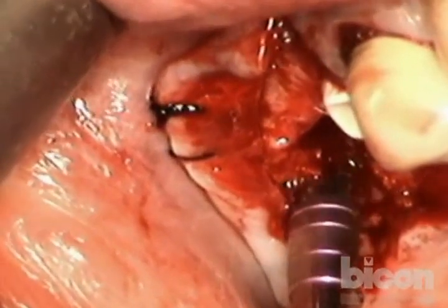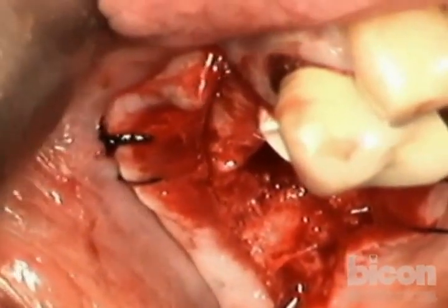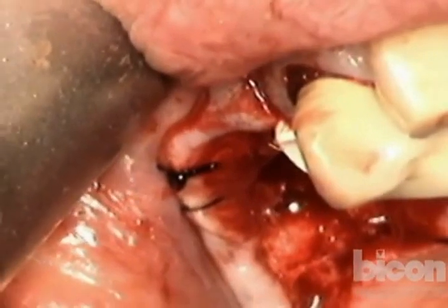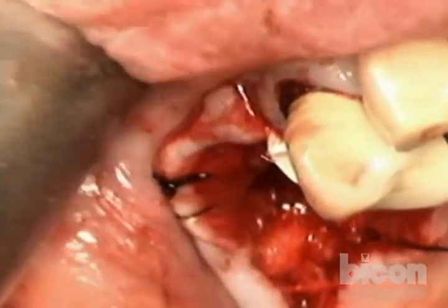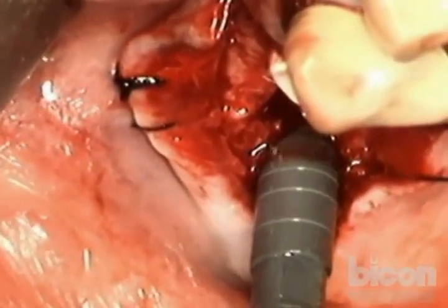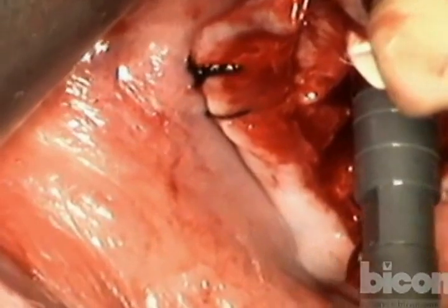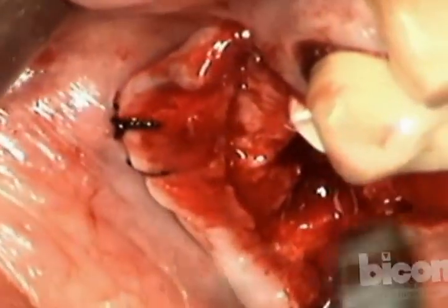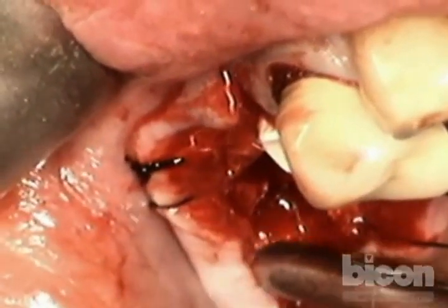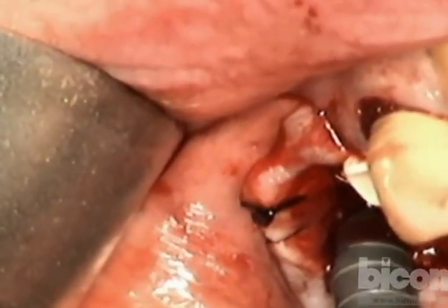Try not to shake like that, if you can help it. Yeah, good job. And what I will do now is use a site expander in the posterior one to see where I am. And I will combine that with the hand reamer. And I'm using the expander in a circular fashion. Okay, hold that. This is basically just a blunt instrument, and you can use it by tapping it in as well.